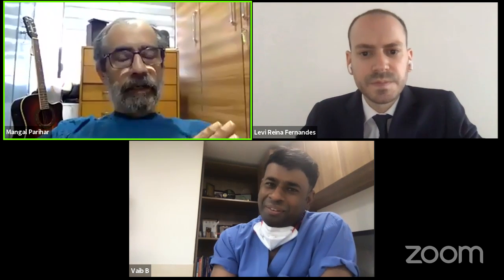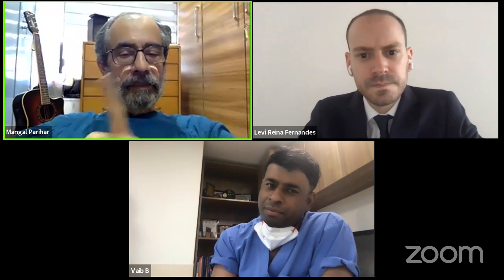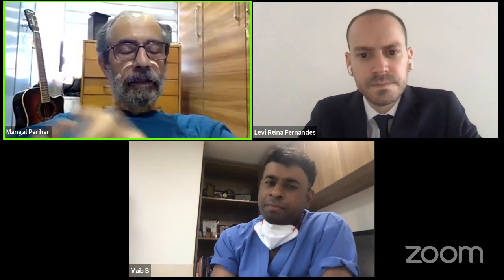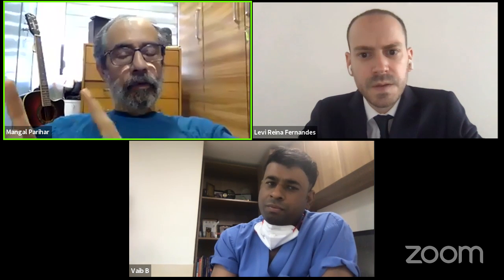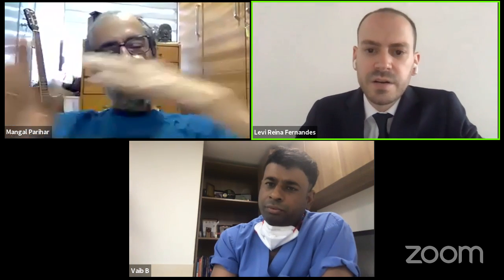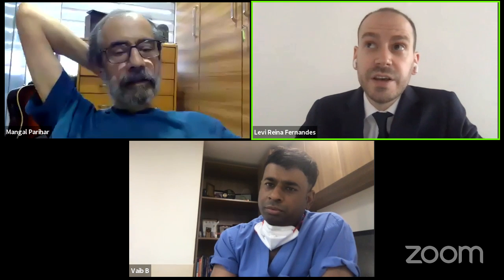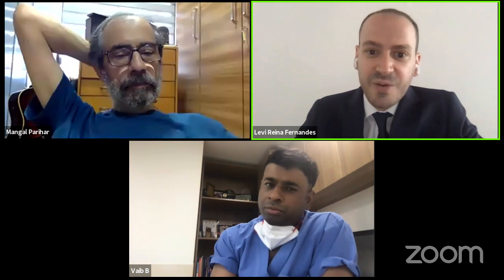Right. That's very interesting, because it leads to a follow-up question. You've done 100 cases. Have you looked at the post-operative measurements with the same software, for the ones you planned for, say, 50%? Yes, that study is on track. But even if you plan it very well, it always depends on the surgical technique.